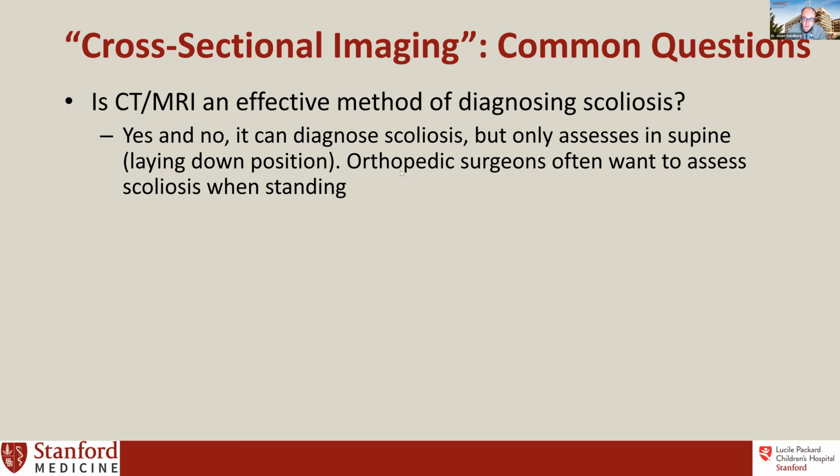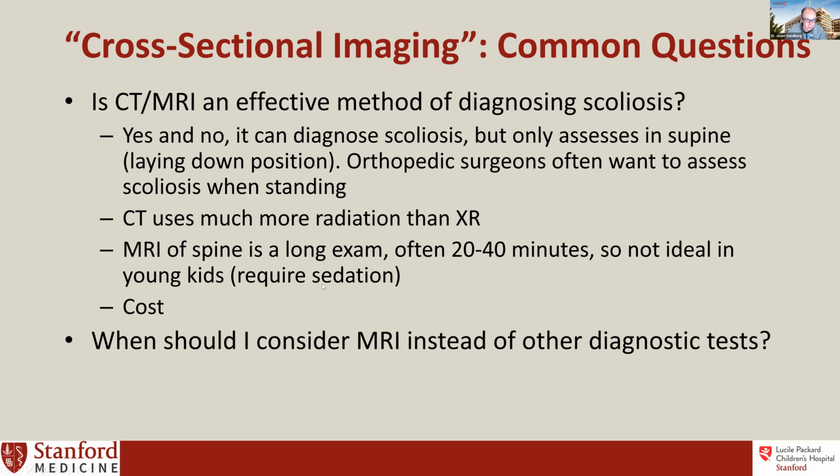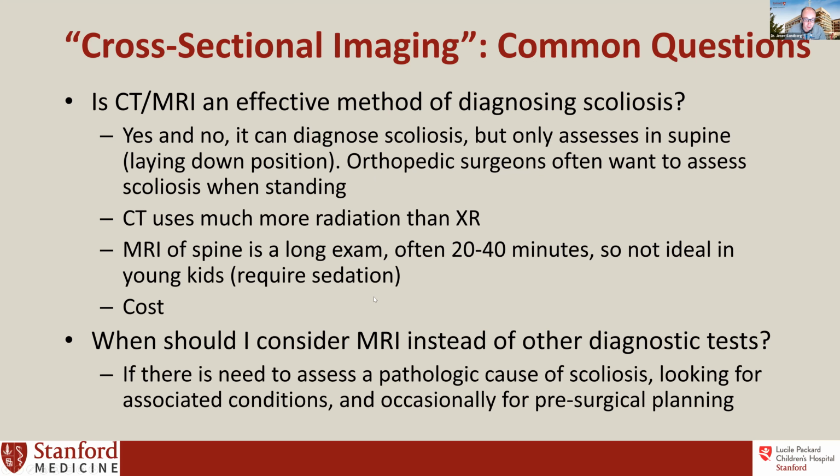And orthopedic surgeons often want to assess scoliosis when standing or in multiple different positions. And as I mentioned, CT uses much more radiation. MRI of spine is a long exam. It could often take a lot of time, so it's not ideal in young kiddos who require sedation. MRI costs more. And then, when should I consider MRI instead of other diagnostic tests? As I mentioned, if we want to assess for pathologic cause of scoliosis or look for any other associated conditions.